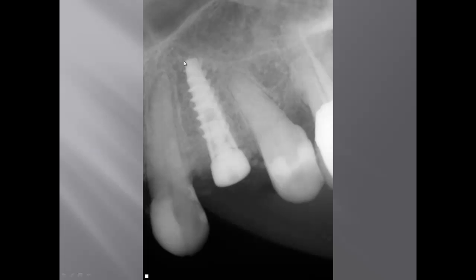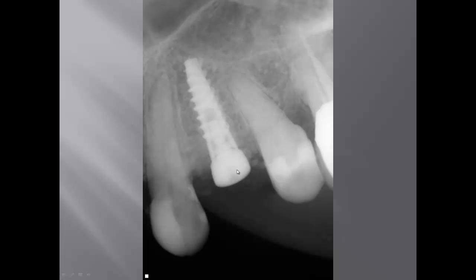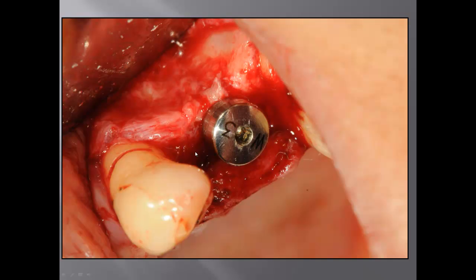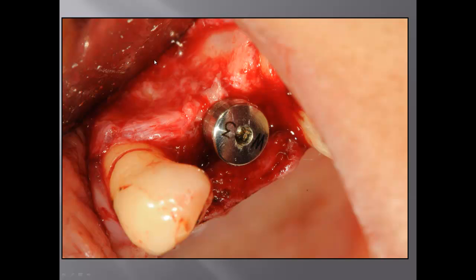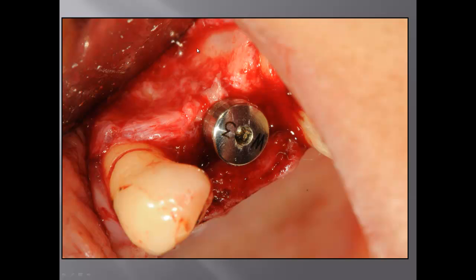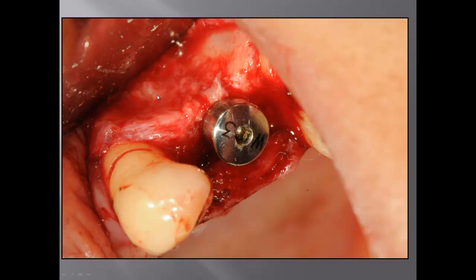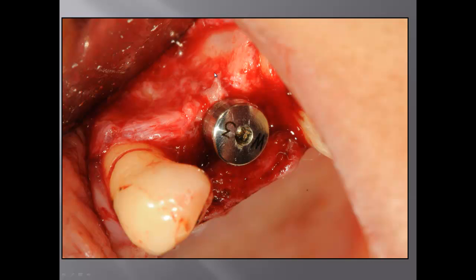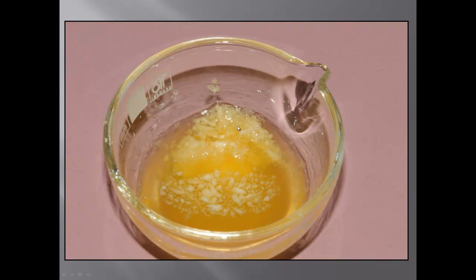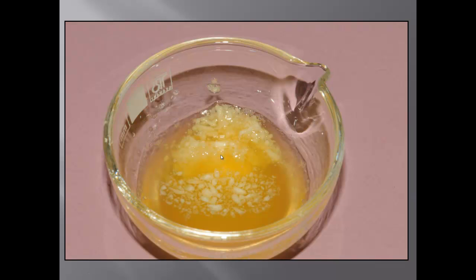This is the final picture of the implant — you can see it's placed almost at the borderline with the sinus. I did a two-stage surgery for this patient, so I placed a healing cap after implant placement. You can see there is no fracture of the buccal plate, but the buccal wall was very thin, so I scored it to get some bleeding. I've been using PRGF lately in my office, and the bone graft has been activated using a combination of cancellous and cortical bone.